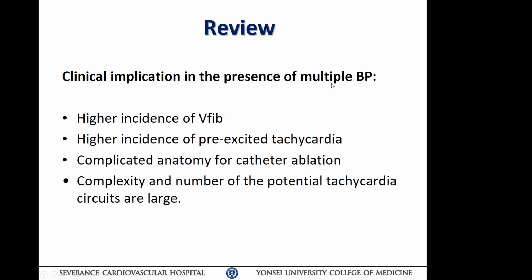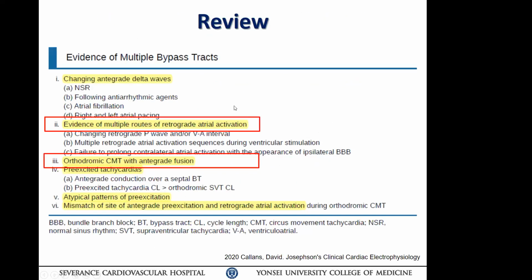Clinical implications of multiple bypass tracts: higher incidence of VFib, higher incidence of pre-excited tachycardia, and complicated anatomy, because sometimes it is associated with congenital heart disease. Sometimes tachycardia changes the delta wave. So there is some evidence to show that the patient has multiple bypass tracts.